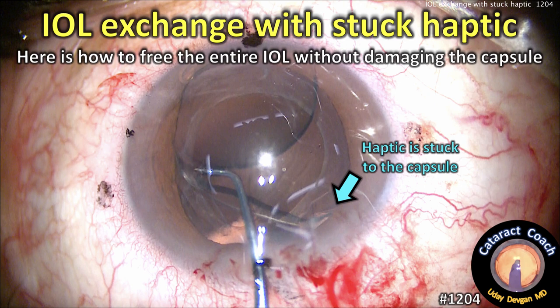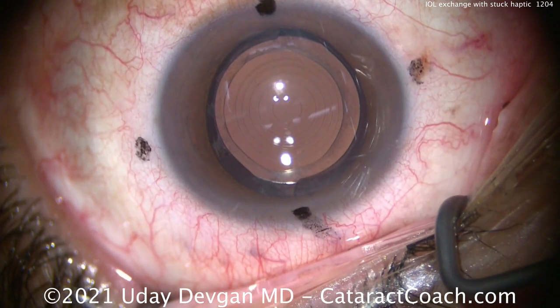CataractCoach.com. IOL exchange with a stuck haptic. Here's how to free the entire IOL without damaging the capsule.